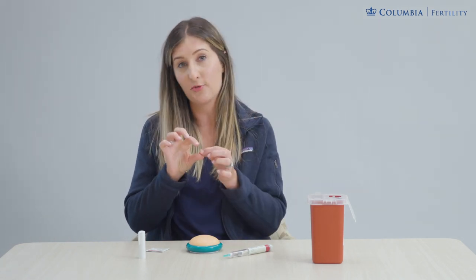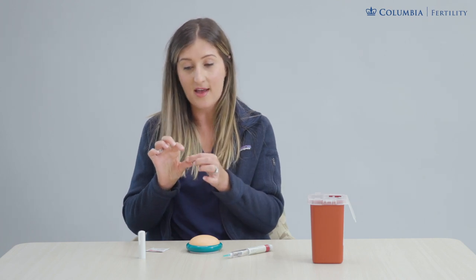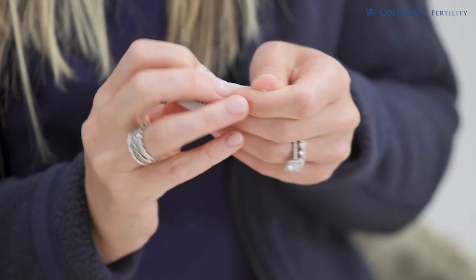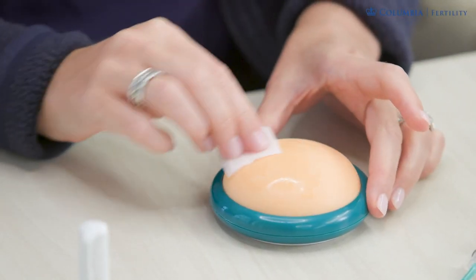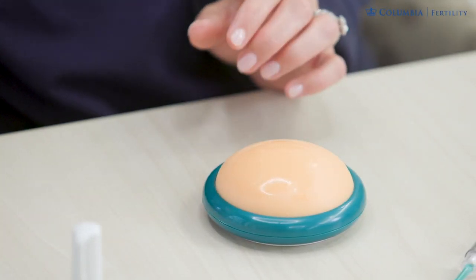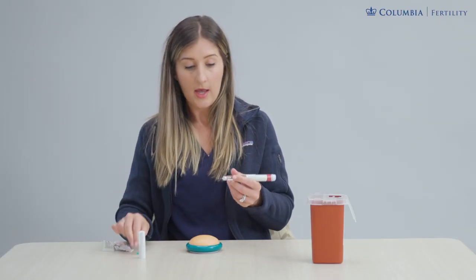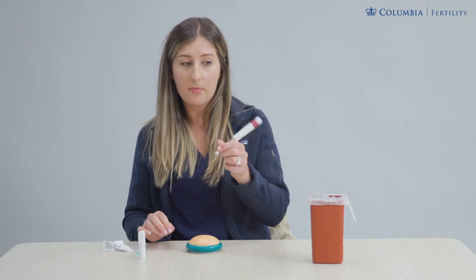These are short half-inch long needles, so you cannot pierce through anything on the other side — anywhere in that U-shaped area is safe. Always make sure your hands are clean, washed, and dried. Take an alcohol swab and swab one of those areas of skin in the U-shape, making sure the skin is clean and letting it dry. Then remove the end cap of the needle and hold the pen at the base like a pen or a dart.